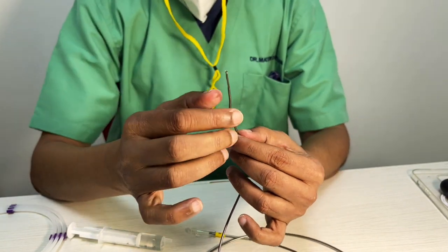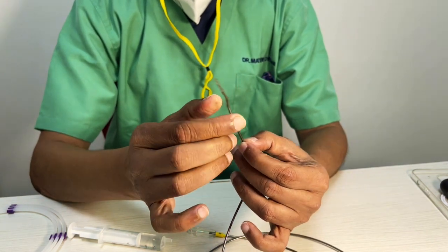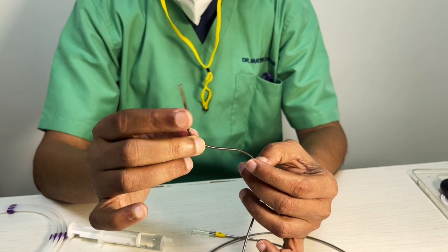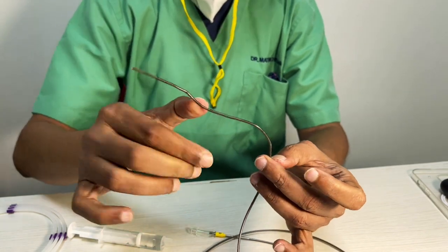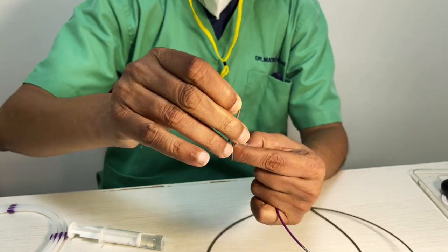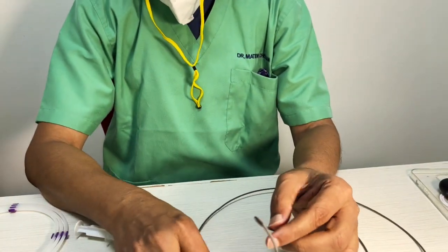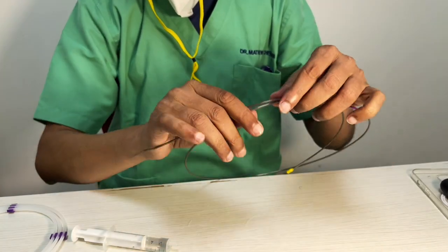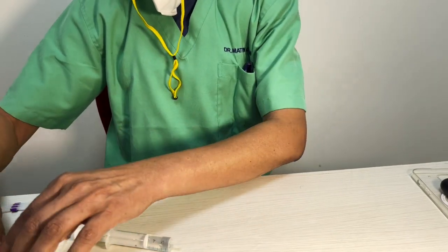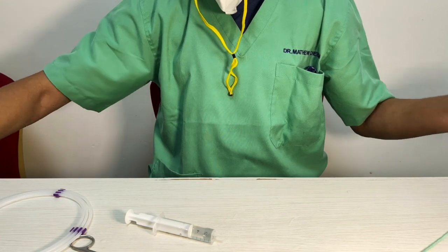So remember one thing, steel gives you the best pushability, but the spirals give you good trackability, but they are not kink resistant. So all over, and this is the reason you'll find if you're working in a complex anatomy and you do a pulling and a pushing, this catheter may completely get deformed. I want to show you another catheter which is made by the same company, Medtronic. This is something recent they did. This is their latest thing. And I'll tell you an interesting property here.